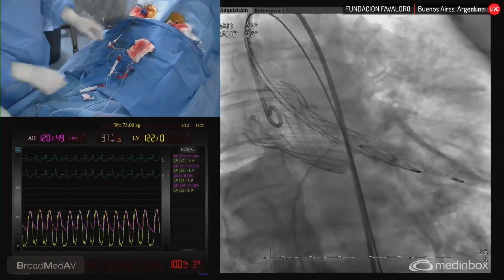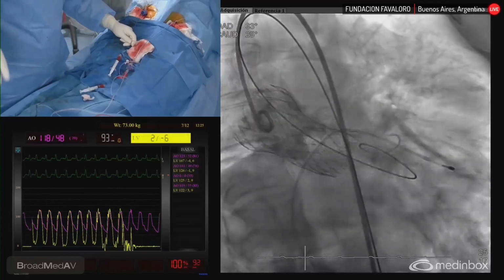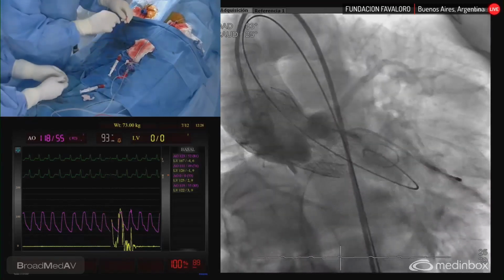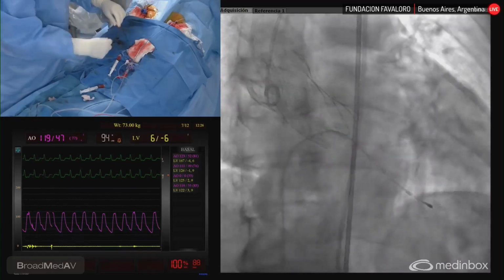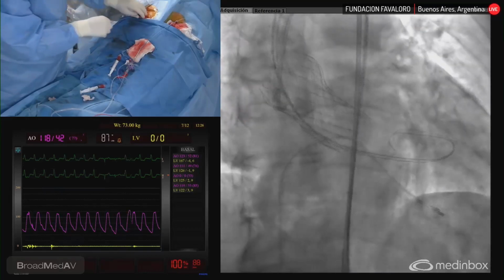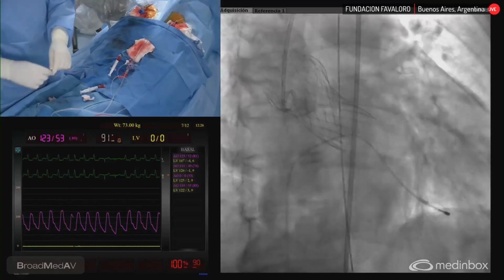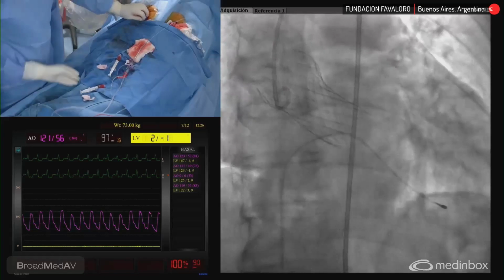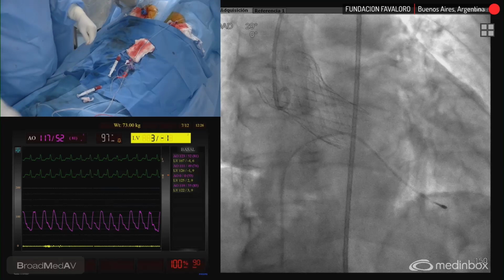So I think we are done. We have to close the groin and pull the pigtail. Maybe Eugenia can do the final measurements without anything inside the valve, and we can close her. And I will show the doctor who was asking me how many Proglides we were using, how we are going to close here, and use the 20 minutes we have.